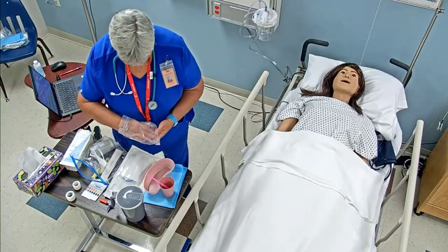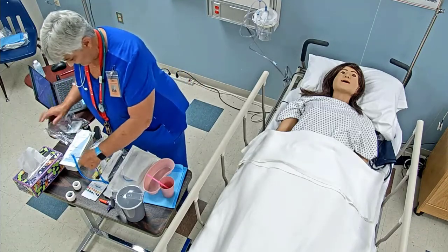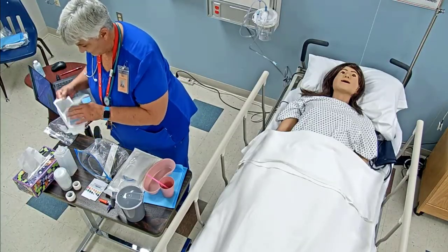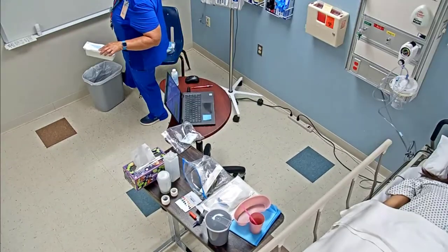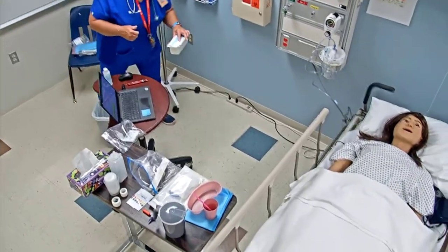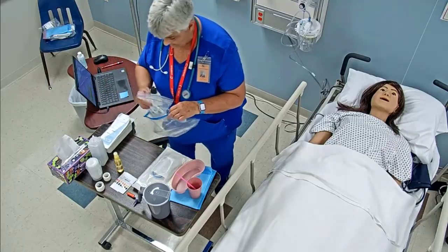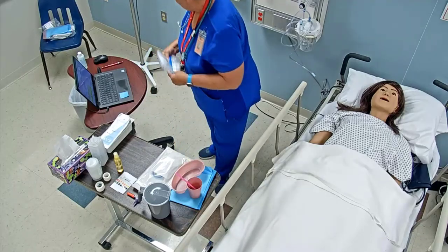Lopez valve, extra. We've got those. Water. And I'm going to go ahead and open up my kit. The other thing I need to do, I'm just going to walk right over here. I'll get that in just a second. So once I get all this connected here, and my lubricant, don't necessarily need that right now. So I think I've got everything. I've got everything here that I need.